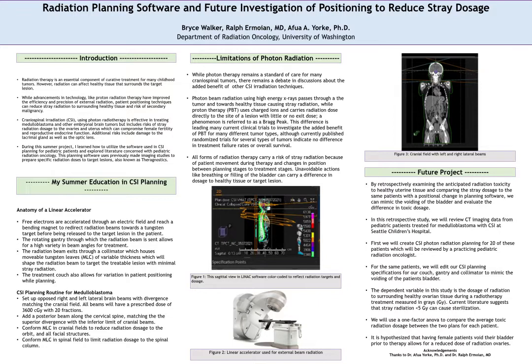So to end out, we do want to talk about just limitations of photon radiation. Like we discussed before, there's obvious limitations because that photon radiation will pass through our target lesion and into healthy tissue. There's also just unavoidable variabilities in radiotherapy with repositioning patients from how they were in their planning scan. Getting it exactly right can be difficult.